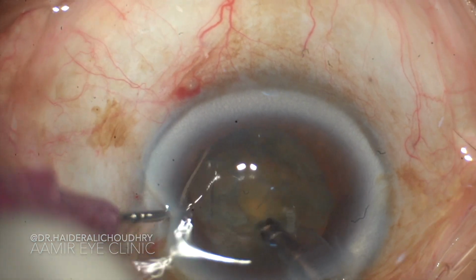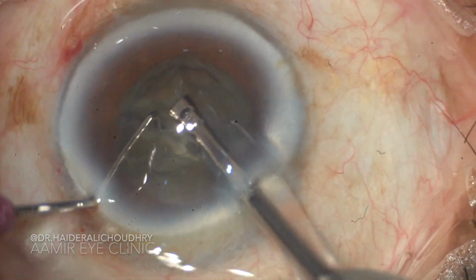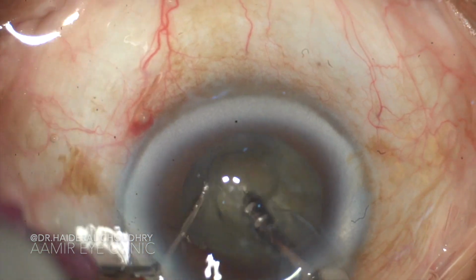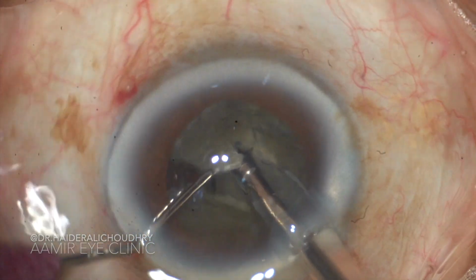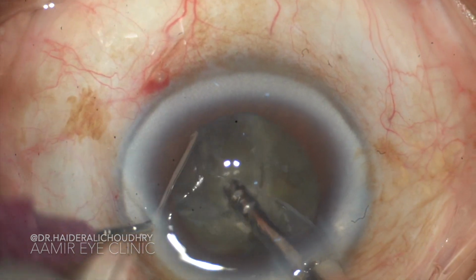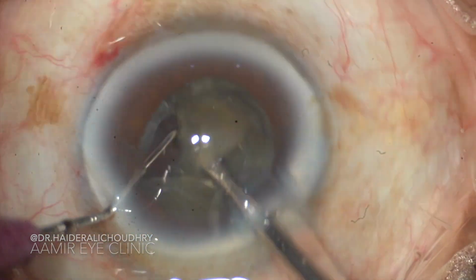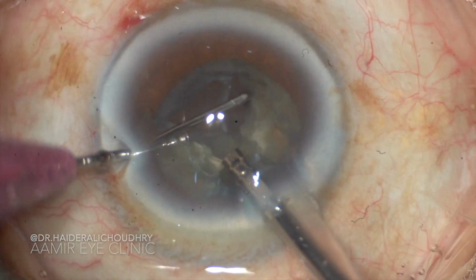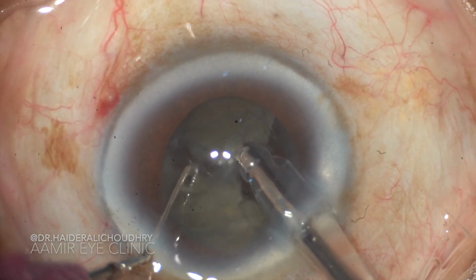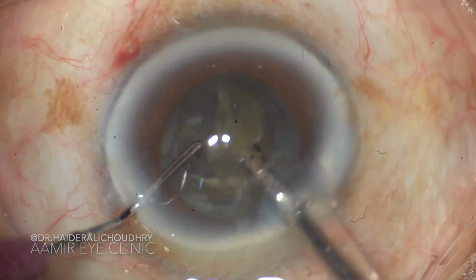We have introduced the phaco tip into the eye, cleaned some of the cortical matter on the anterior aspect of the nucleus, and perform the horizontal chop to get a beautiful crack right down the middle. Then we continue rotating the nucleus in a clockwise fashion and keep chopping to get the smaller fragments, which we emulsify at the pupillary plane.